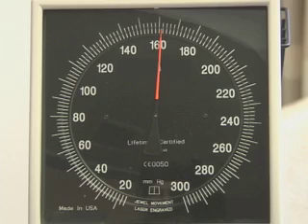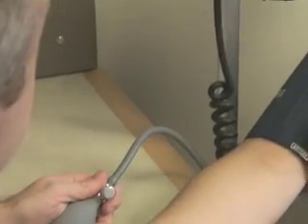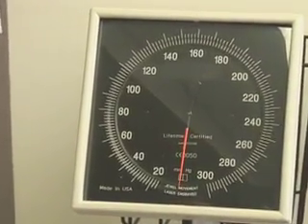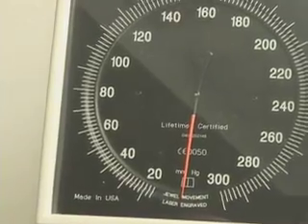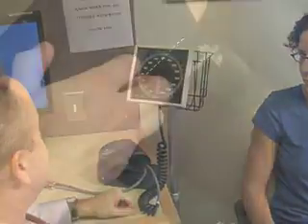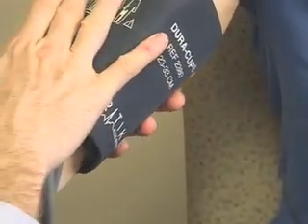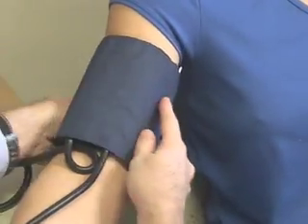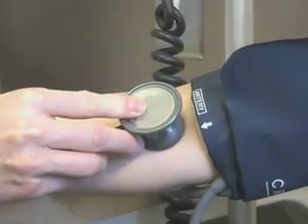Certain conditions may complicate blood pressure measurement or interpretation. In such settings, decreasing the rate of deflation and averaging several readings may improve accuracy. Observer bias is usually the most common error that occurs in blood pressure measurements. It occurs because practitioners often show digit preference and rounding of the terminal digit. When two people use the same correct technique for measuring blood pressure, there should be little inter-observer variation.